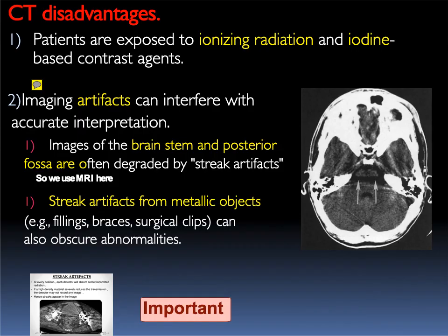The problem with the CT is the patient is exposed to ionizing radiation and sometimes to iodine-based contrast agents. So contrast reaction can occur in renal impairment if you don't take precautions about that.